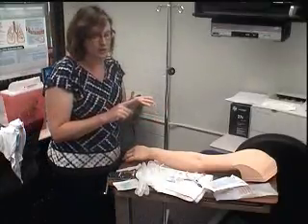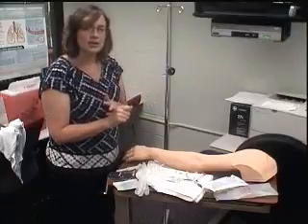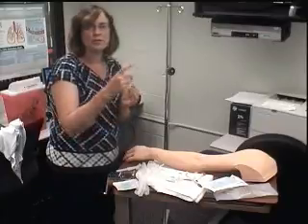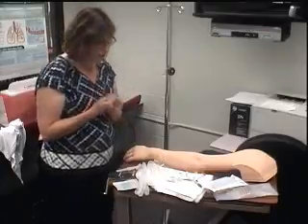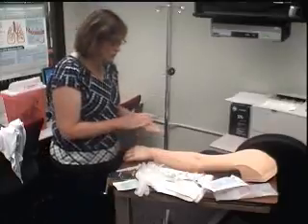So I'm going to look at all those labs, the sodium and the chloride. I may even want to check their H&H. If it's low, I would be considering, well, am I in the future going to have to give them blood? Maybe I would be wanting to use not a 22 gauge. Maybe I'd want a 20 gauge. That's about the smallest I would use for blood. So I'd use an 18 or 20.